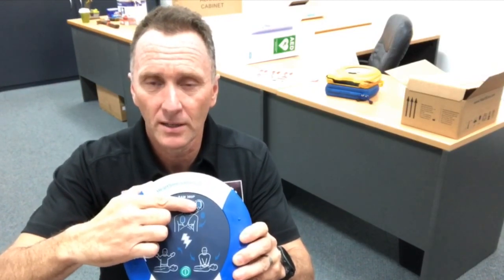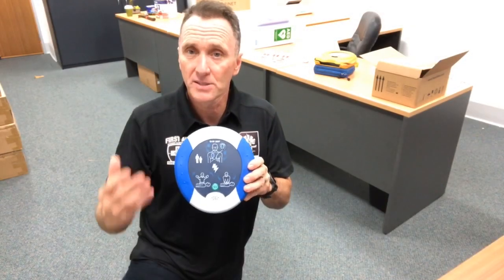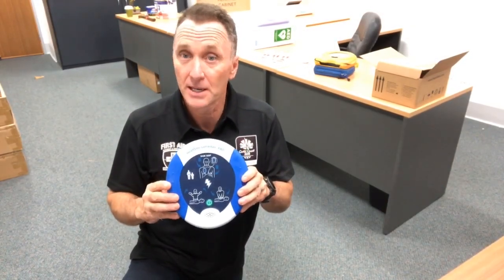It's also recommended that you check your HeartSign 360p defibrillator each week before the event. Simply look at the top right-hand side of the device — if there is a green flashing light, the system and the defibrillator is good to go.